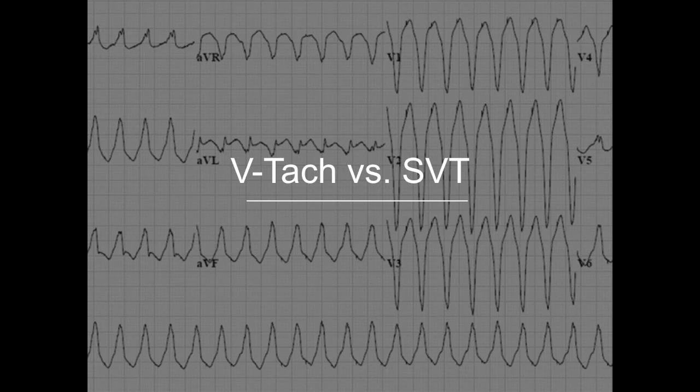Today, let's talk about V-Tach versus SVT, and more appropriately, aberrant SVT. In each case, we have this wide complex tachycardia. Is it V-Tach or is it SVT? Because our treatment's going to differ a little bit. Our approach to this patient is going to differ, sometimes pretty drastically, between V-Tach and SVT. So let's talk about our wide complex tachycardias and how to distinguish V-Tach versus an aberrant SVT.